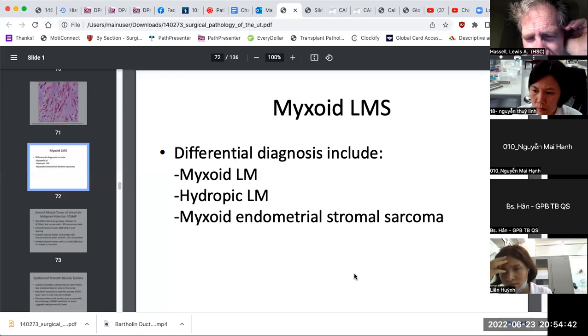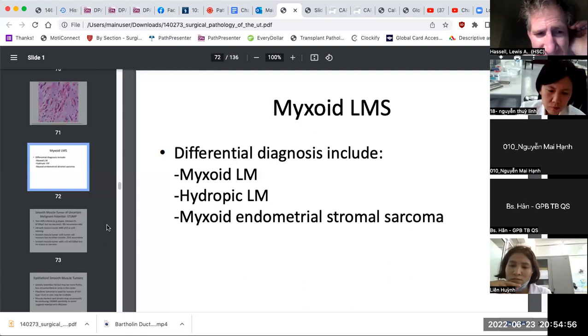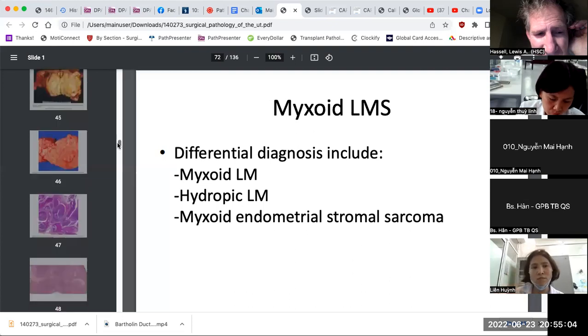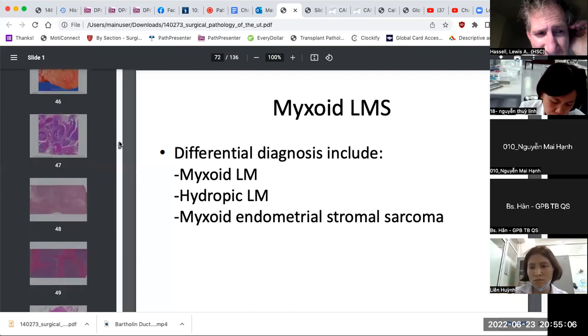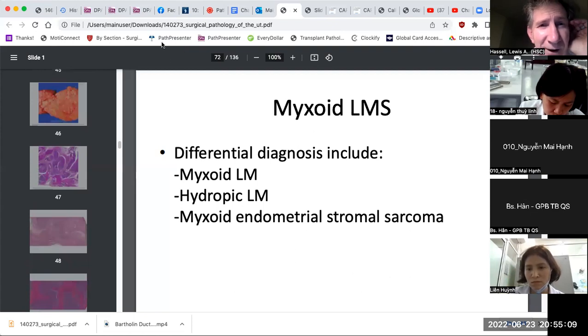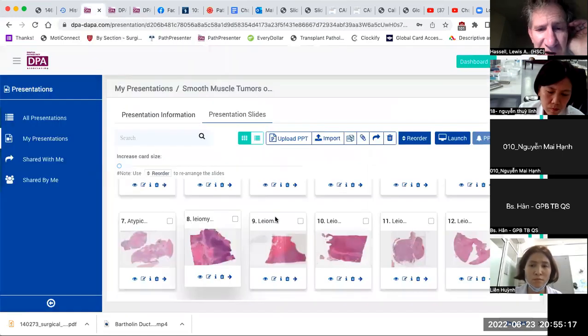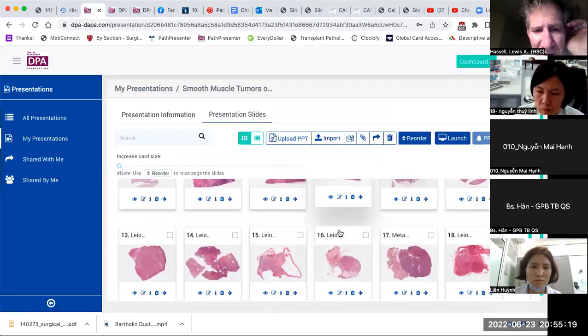Yes, so could you please tell me again how to differentiate leiomyosarcoma and endometrial sarcomas in general, especially when the leiomyosarcoma can be positive for CD10? In our practice, we don't have the fusion gene testing. So what are some useful markers for differentiating the two entities?